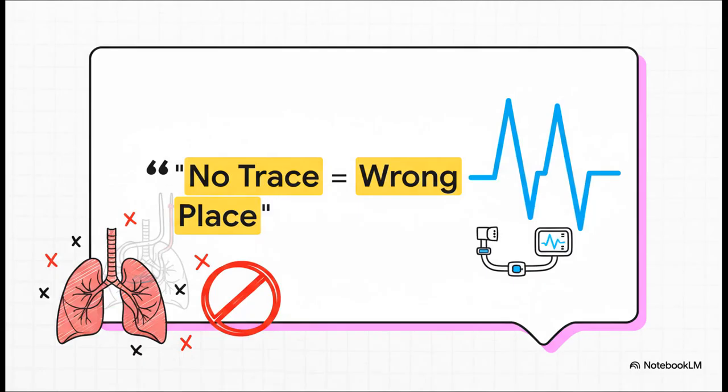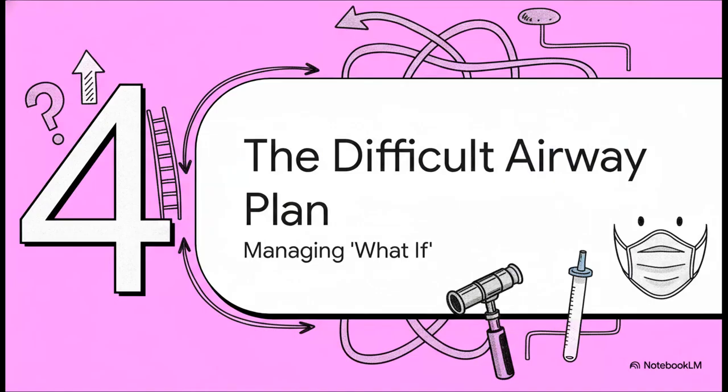And how do we confirm it? There is one non-negotiable. Absolute gold standard. This slogan says it all. No trace equals wrong place. If you do not see a continuous, beautiful waveform on your capnography monitor, you are not in the trachea. End of story.